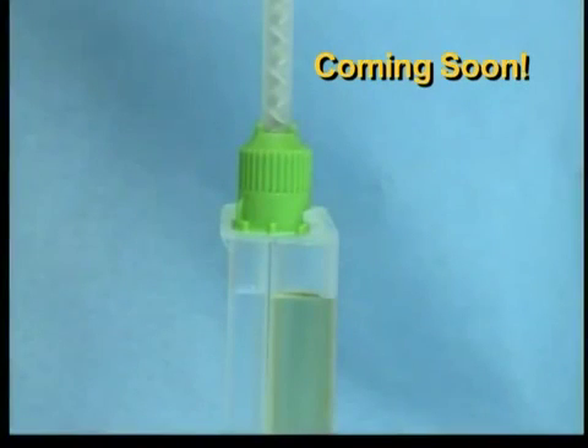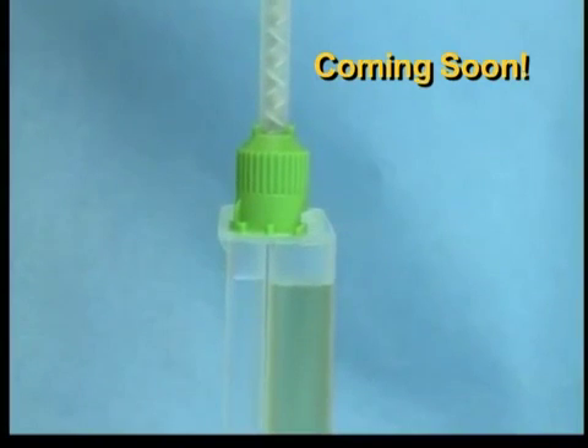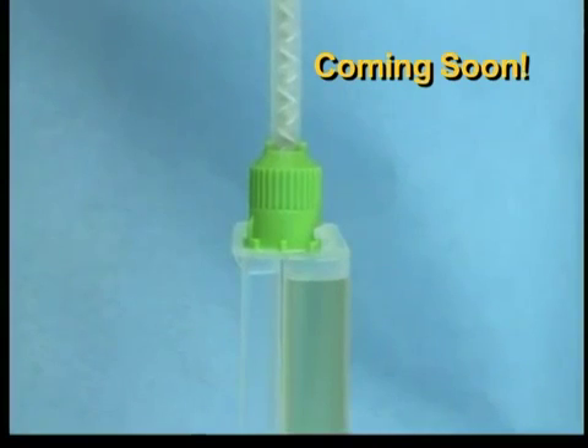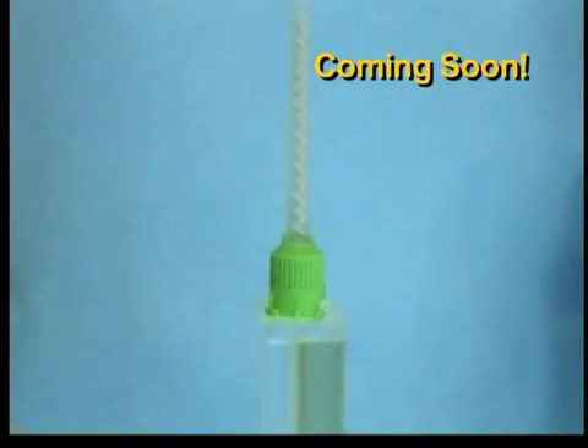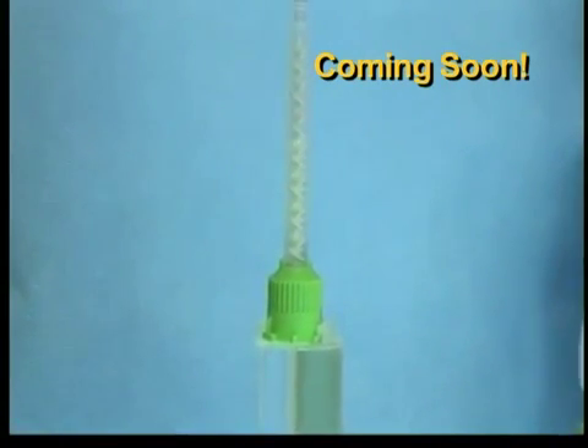It is important to remove the air in the syringe prior to BioGlue application. This can be accomplished using one of two methods. If using the first method, compress the plunger only until the bubbles are even with the top of the syringe body. If using the second method, compress the plunger until both solutions can be visibly seen above the opaque base of the spreader tip.